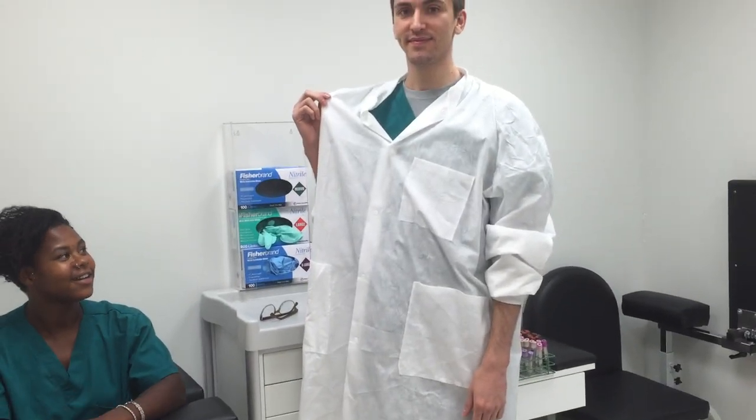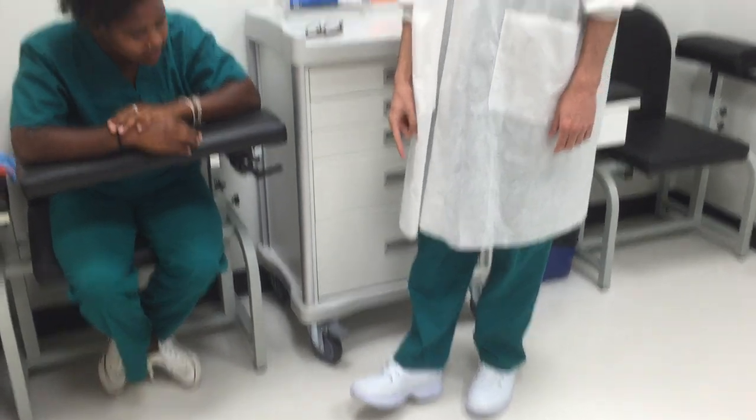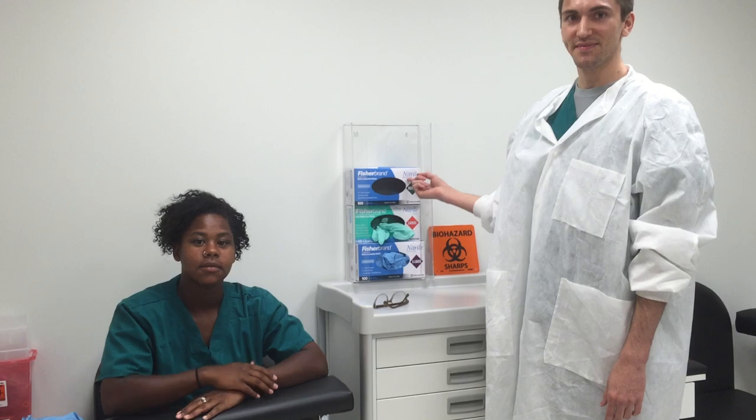First, you will need a lab coat. Second, you will need some protective shoe wear. Also, you will need some gloves.